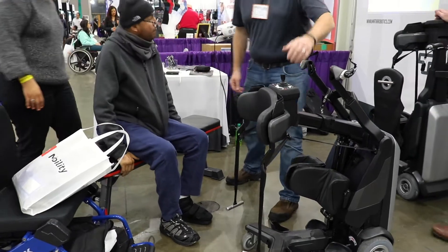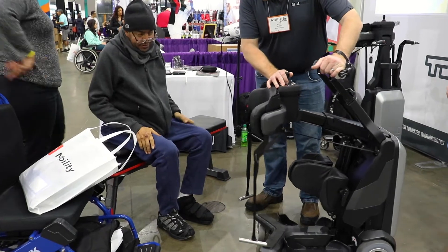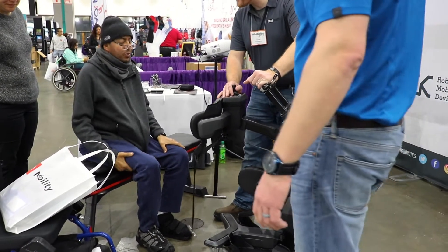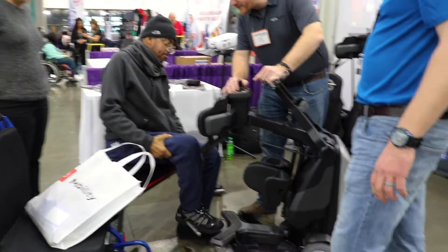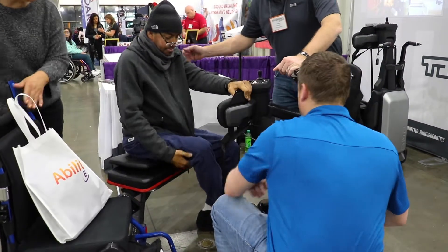We should have just started with this — I don't know what I was thinking. It's because the wheelchair is too... This is a lazy one. I don't know the wheelchair, I don't know the manual. When I come to the shows and go to places that I like to buy one, it seems like everybody gets the fixed foot plate, which is great, but it makes it a great challenge for this.